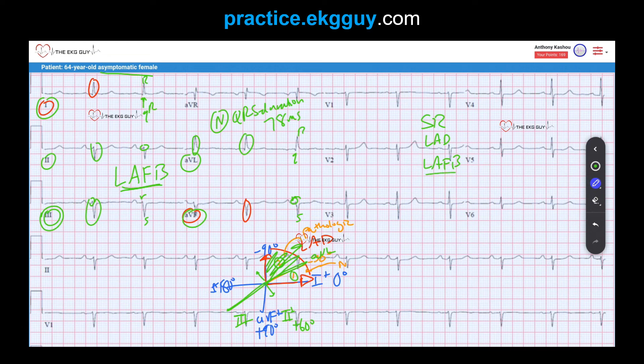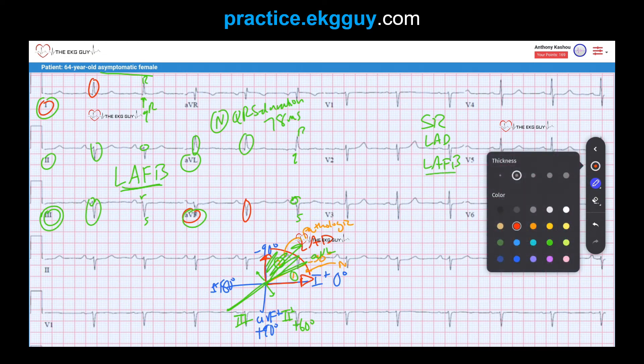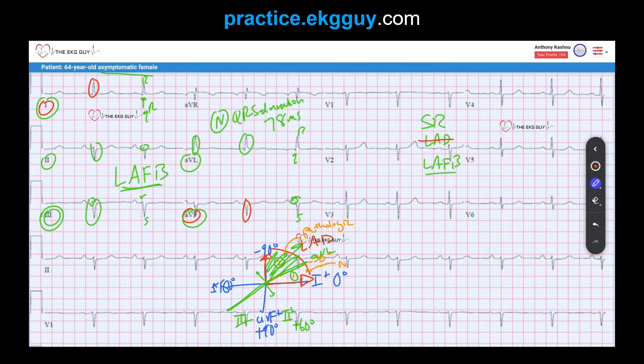An important tip: we identified sinus rhythm and left anterior fascicular block. If we make the diagnosis of left anterior fascicular block, we do not also separately diagnose left axis deviation, because the left axis deviation is essentially implied by and resulted from the LAFB diagnosis. So the two main findings are sinus rhythm and left anterior fascicular block.